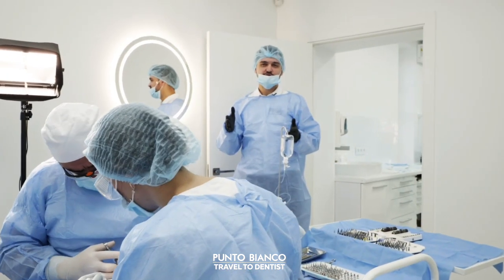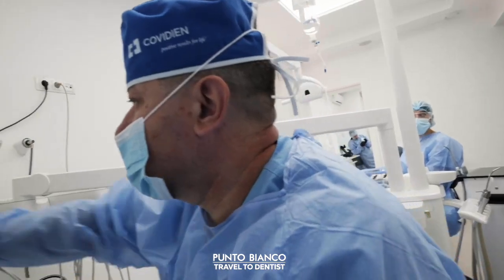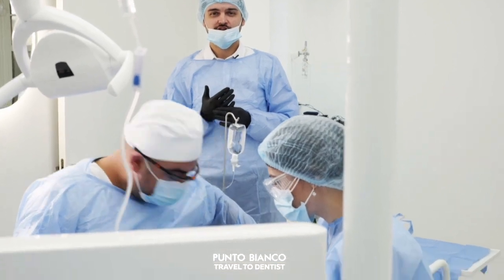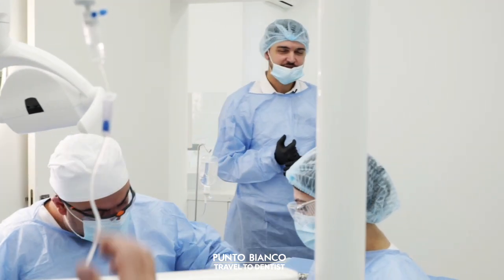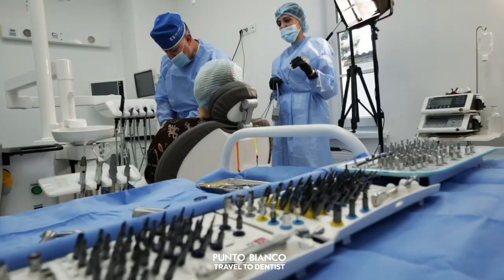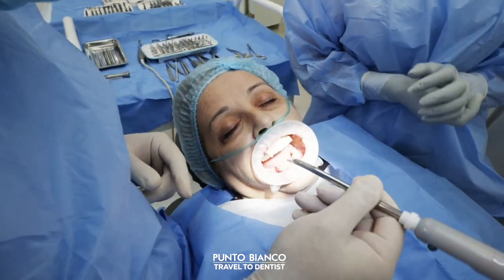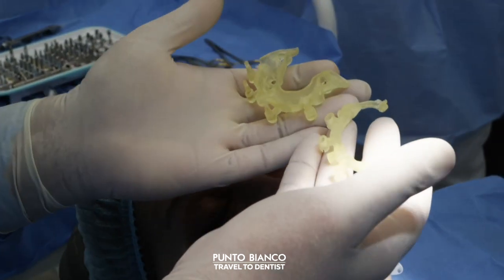The patient is currently sleeping. As you can observe, the treatment will be completely finished while she is in a state of sleep. We have the anesthesiologist in the office who will guarantee a safe and comfortable treatment for patients and will initiate the procedure. So these are the initial set of guides, the fundamental guide and the guide for fixing pins.